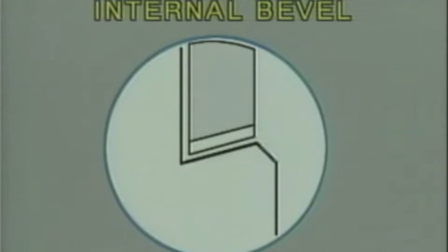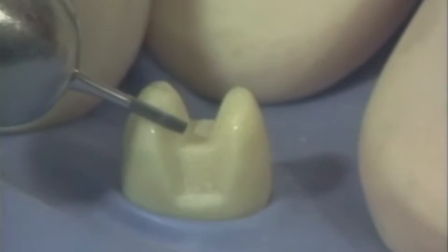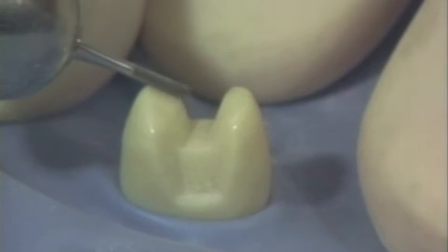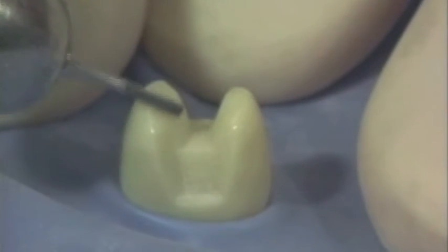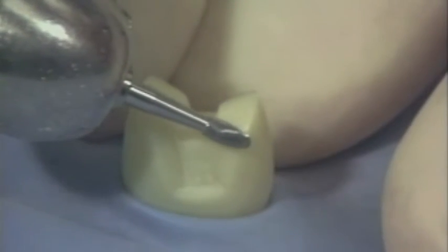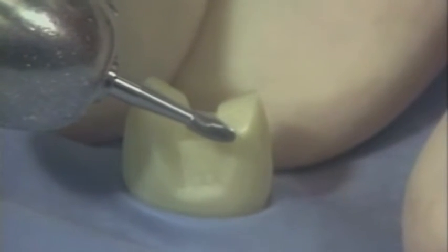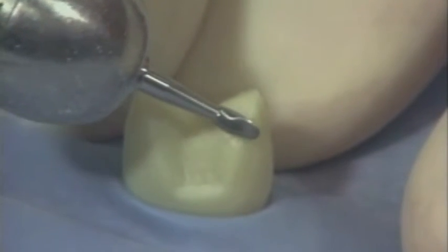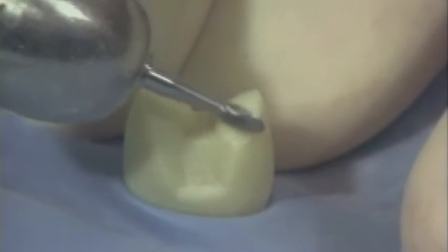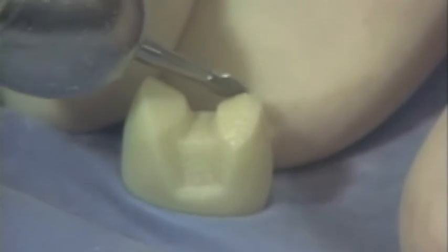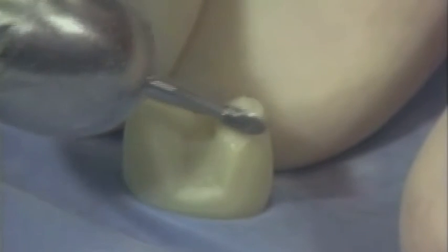These scenes of preparation procedure on an ivory tooth show the typical procedure of initial reduction of cusps with the number 57 burr, followed by the number 7404 burr, which places a counter bevel in a smooth and efficient manner. On the lingual, it creates a counter bevel margin that has good definition and allows a bulk of gold at the margin due to the hollow grinding effect.